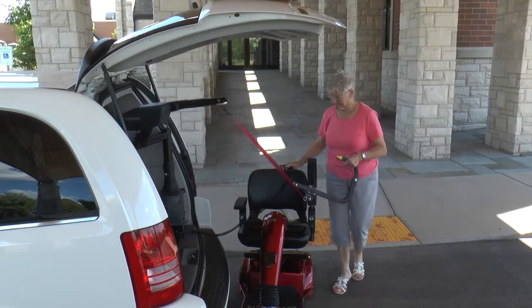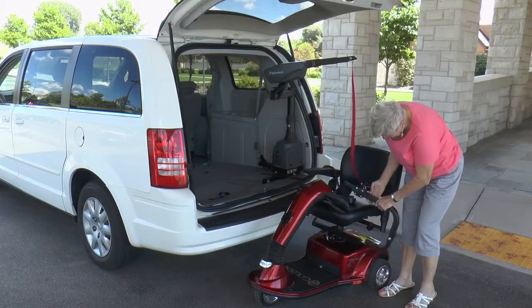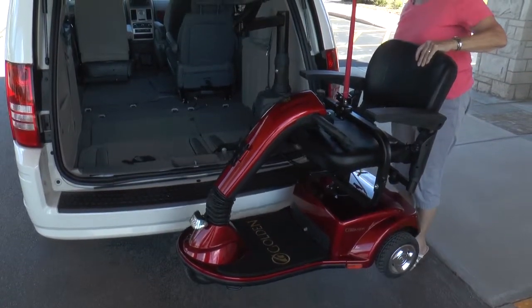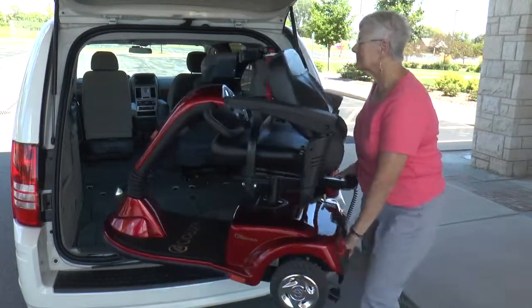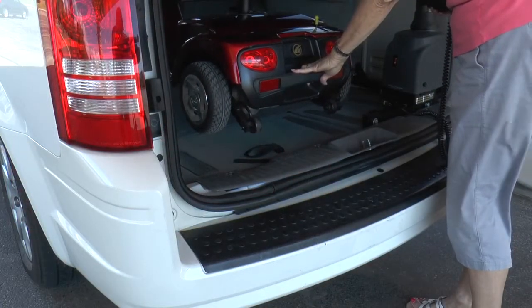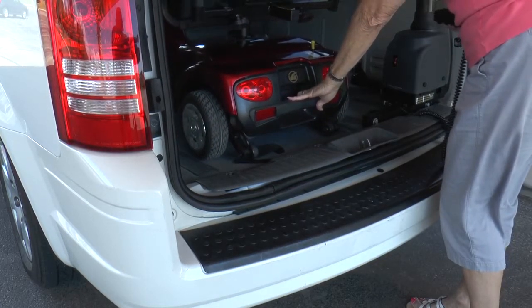To use a Curbsider, simply stand by the curb or rear bumper of the vehicle and attach the custom docking device to your scooter or power chair. Push the button and the Curbsider power raises and rotates the mobility device inside your vehicle. You need only to gently guide it into position for storage. Once the scooter or power chair is inside your vehicle, just press the button to lower to the floor and the docking device stays in place during transit.